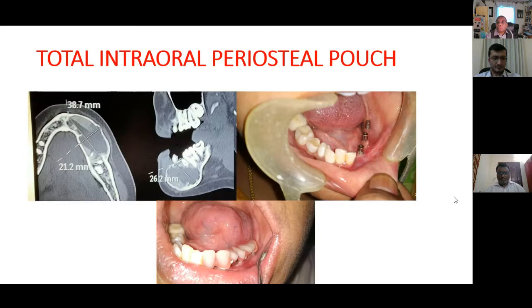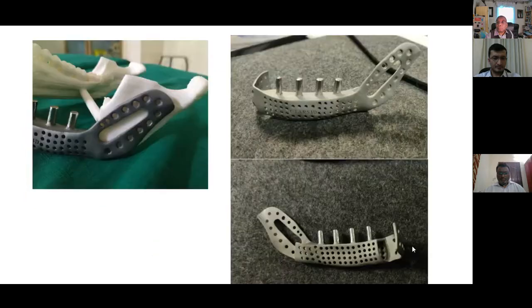They slowly hatched in around 15 days. It took 15 days for these 3 abutments to slowly hatch into the oral cavity, and almost 1.5 months for this 6 millimeter of exposure, on which we gave temporaries. Now the patient has permanent, cemented teeth.